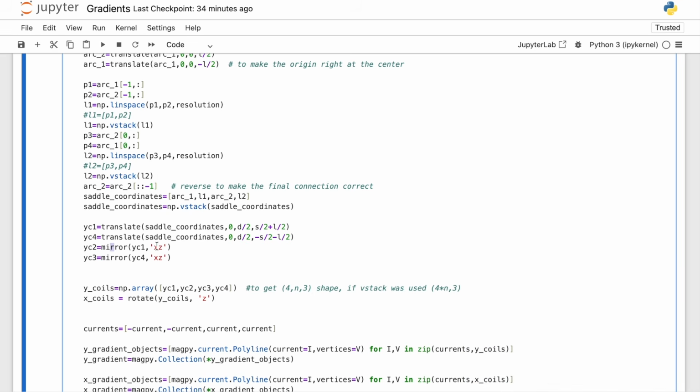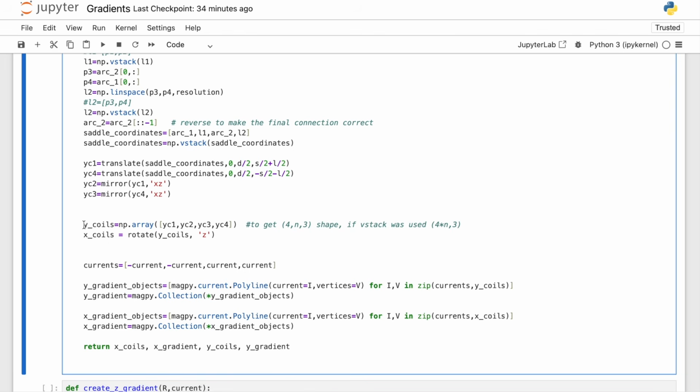in the xz plane. And then as we can see here, once we have the y coils in an array, this array is in shape 4n3, which means we have 4 coils. Each coil has n points, and each point has 3 values or 3 coordinates. So once I have my y coils, creating the x coils is just one line, because we just rotate it in the z axis, and this rotation is a 90-degree rotation. So here we can see how much the rotate function simplifies our code.